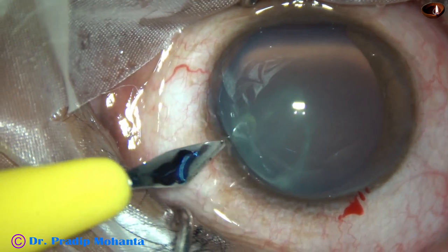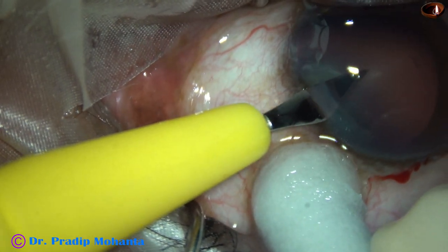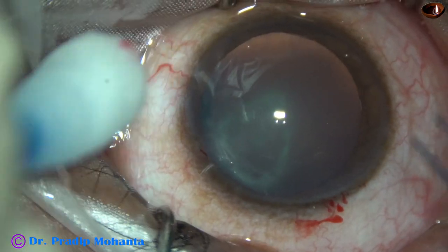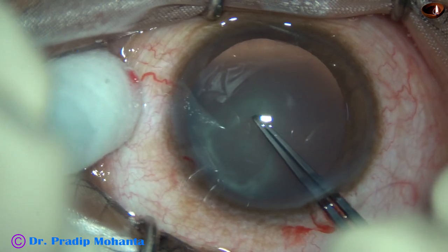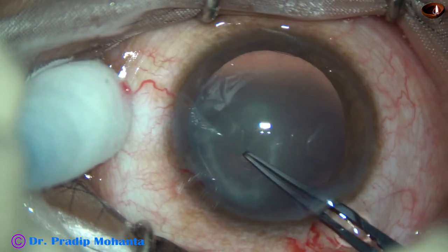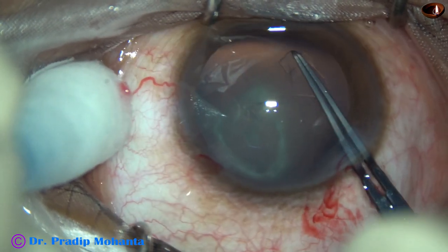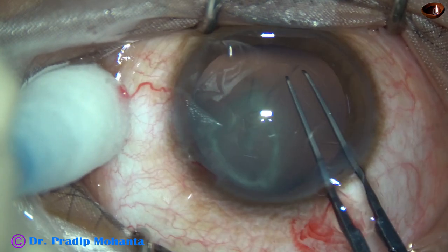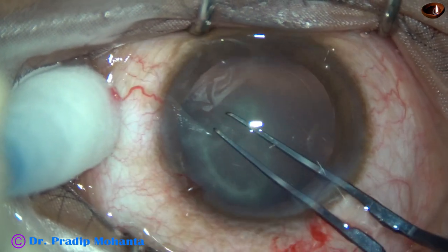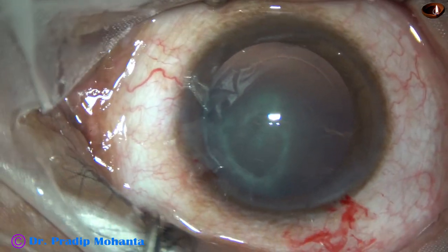A side port is made on the left side of the main incision, and then capsulorhexis. Utrata forceps is being used to do the rhexis. The anterior capsule is torn at the central part, a capsular tag is raised, and guided anticlockwise all around to get an adequate-sized rhexis.